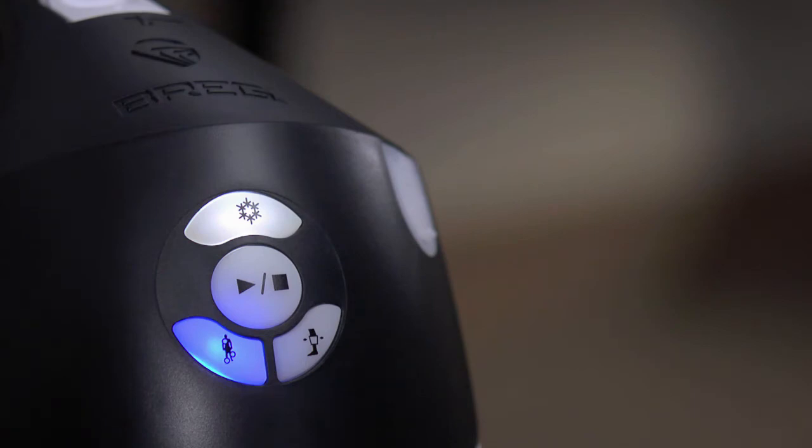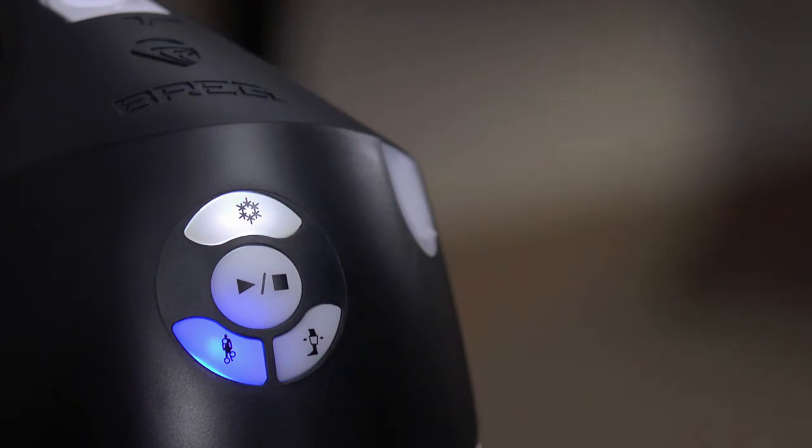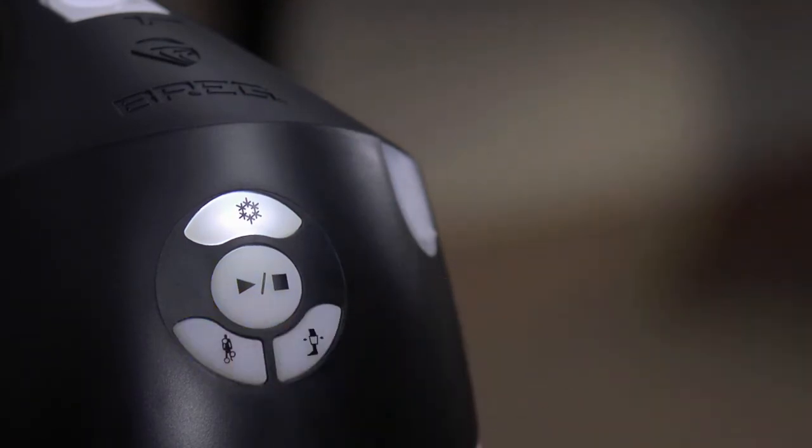Once you've selected your therapies, then push the center start stop button to begin. The start stop button will illuminate green when the system is running. You can change the settings only when the system is stopped. Press the start stop button to turn off the system, add or change your therapy selections, and then press the start stop button again to restart.